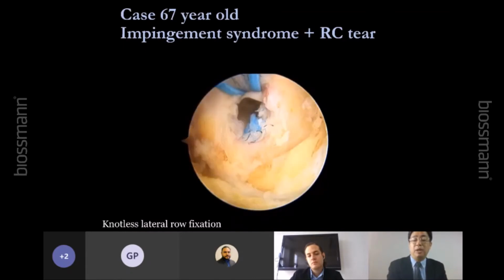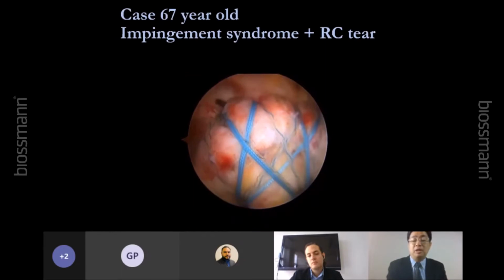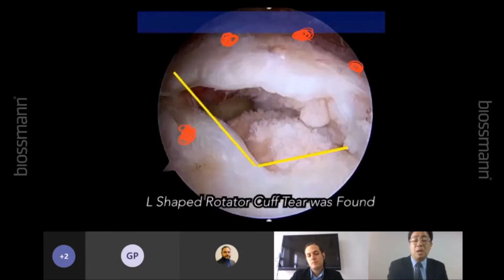Okay, and then we try to spread the cuff as wide as possible. Okay, so this is the 3-in-1 hole. You see that it is nicely reduced, and also there's a good pressure distribution. So in some patients, this is an L-shaped tear, right? We need to design. So I plan to put 1, 2, 3, and 4 holes.